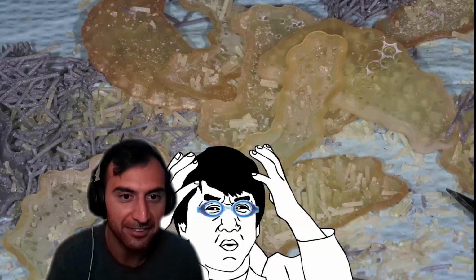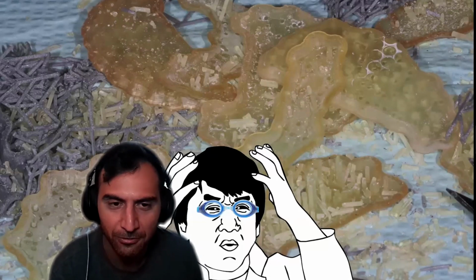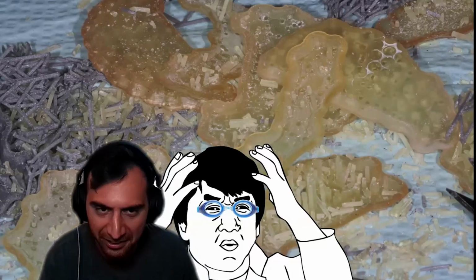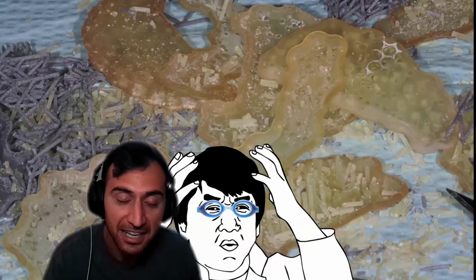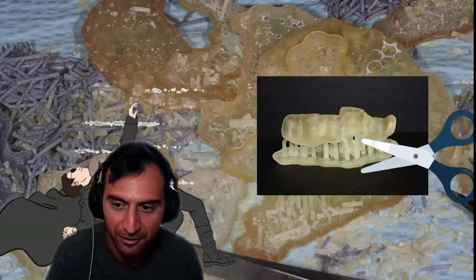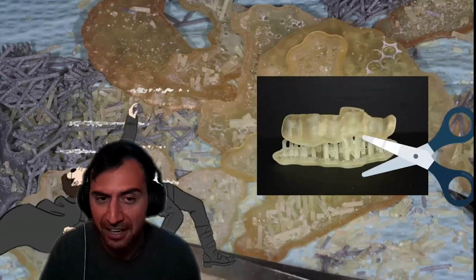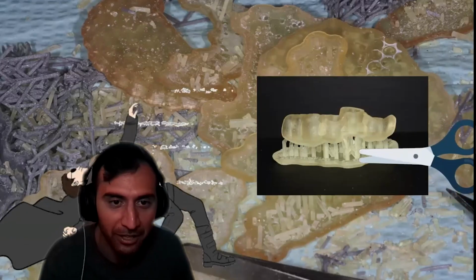Yes, it can create a mess. This is the part of the talk where I'm going to tell you where it gets real. There are some issues with 3D printing too. I love this stuff. Some issues. It does create a mess. All those sticks and stuff pop off there, you have to be able to throw it away. Sometimes when you clip those sticks, make sure you're wearing glasses because they can fly at your eyes. And tell me how I know.